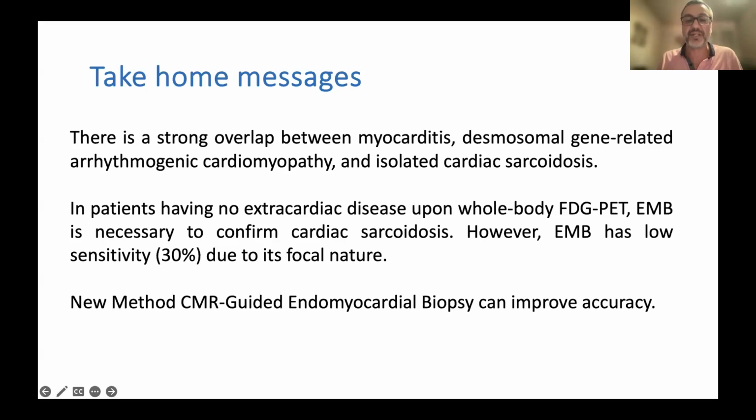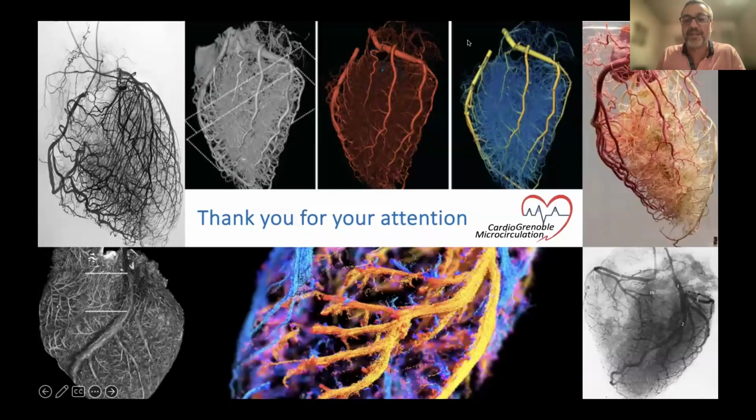Finally, endomyocardial biopsy is necessary to confirm cardiac sarcoidosis. However, in this case, the endomyocardial biopsy had low sensitivity, particularly due to its focal nature. And in this context, the new method, CMR-guided endomyocardial biopsy, can improve accuracy, but for the moment it's not perfect, it's not totally automatic, but it's in progress. And I use this for different patients, and that is one case of my experience. Thank you very much for your attention.